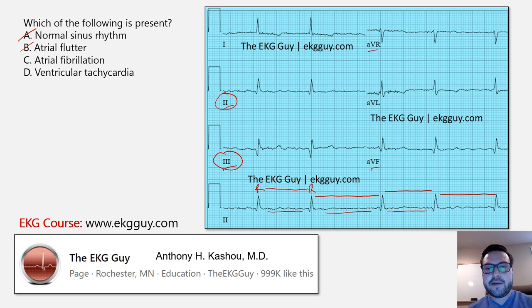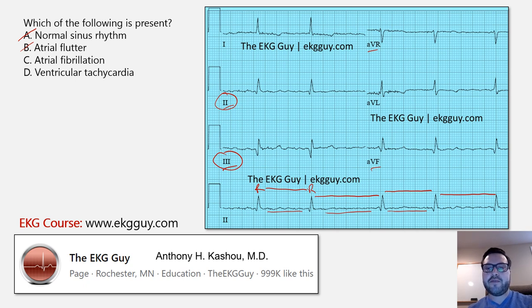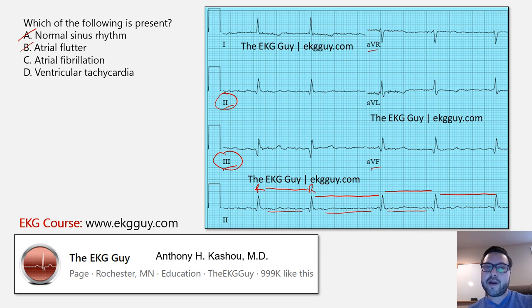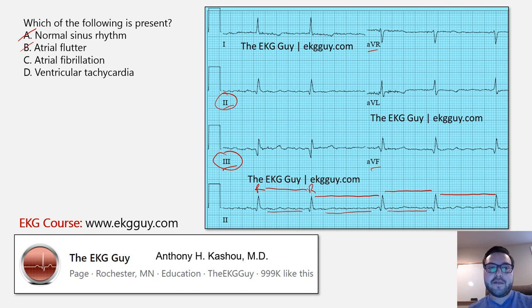Atrial fibrillation is where the rhythm originates from the atria, as the name implies. This is chaotic firing of atrial ectopic foci, and some of them get through. Because they're coming from all different areas in the atria — there are a few proposed mechanisms — some eventually make it through. Because they're going so fast and bombarding the AV node, not all of them conduct through, and they come through at an irregularly irregular rhythm in conduction through the ventricles. That actually fits the diagnosis here.